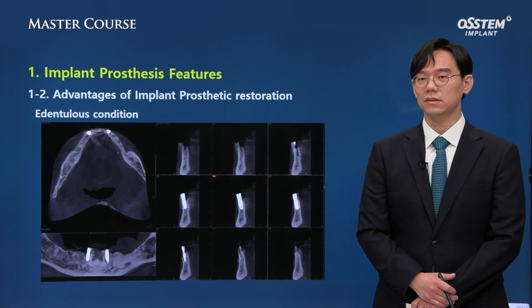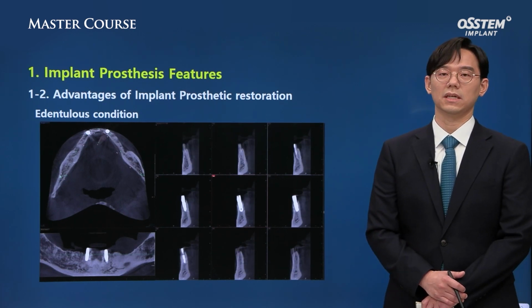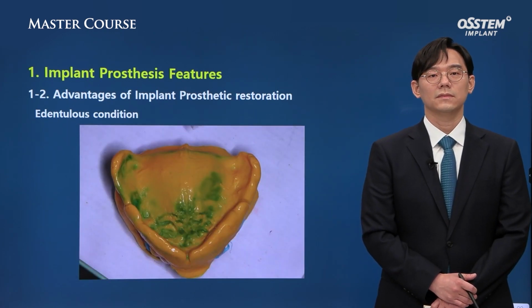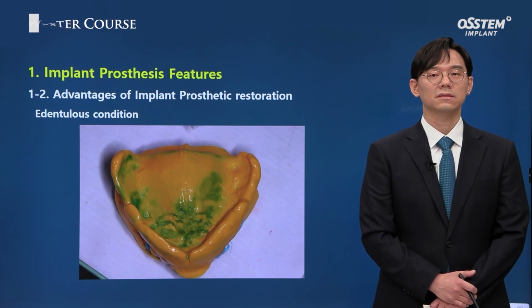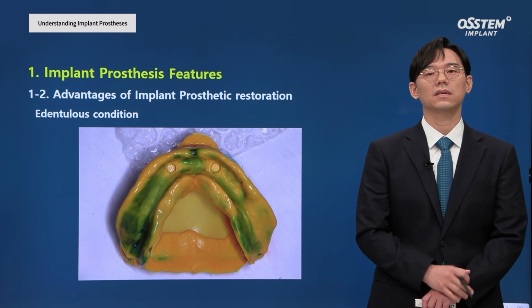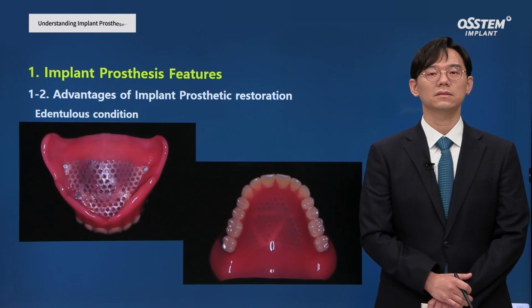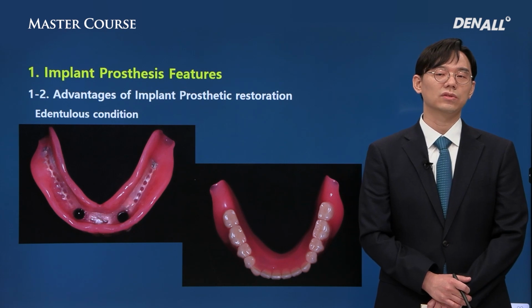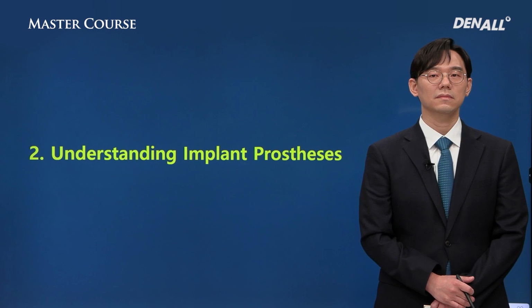This is implant section image. This is the right and left after placement. I tried to place the implants parallel to each other. As for the upper, impression for full denture treatment was taken. And for the lower, locator and housing were connected and impression was taken. This is upper denture and this is denture in the lower. Locator housing was bonded using hard lining resin intraorally.